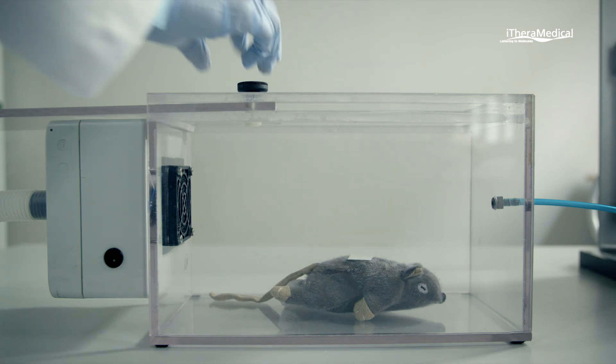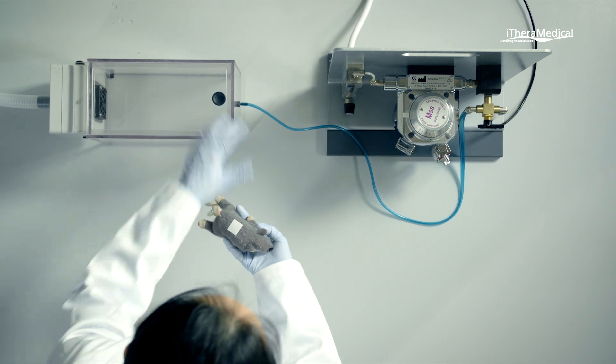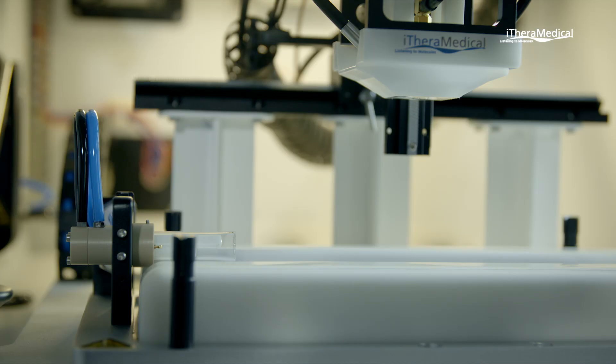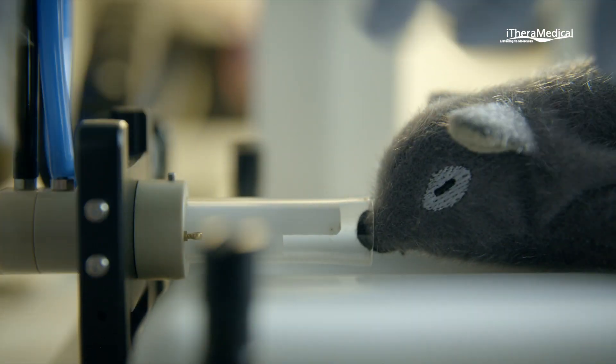Isoflurane is used to anesthetize the animal. Once the animal is anesthetized, anesthesia is switched to the RSOM Explorer, and the animal is transferred to the small animal bed inside the imaging chamber.